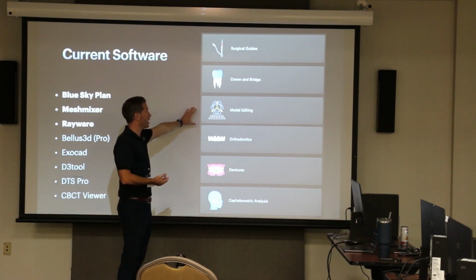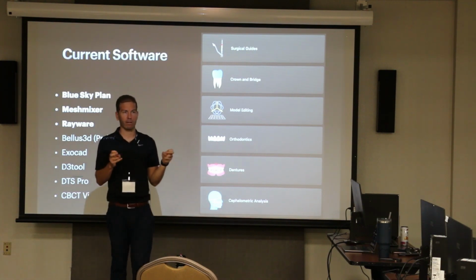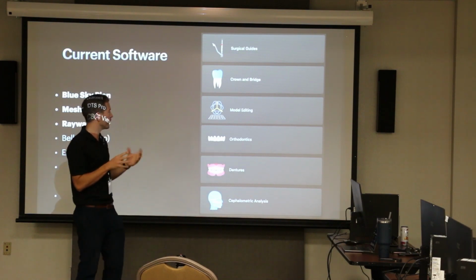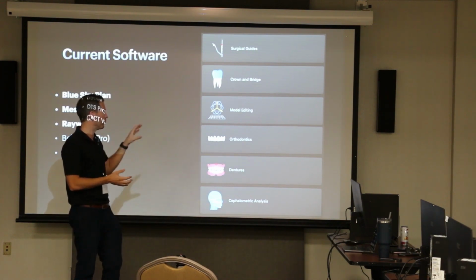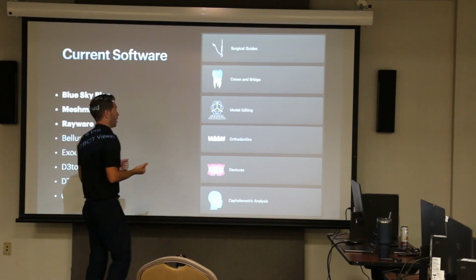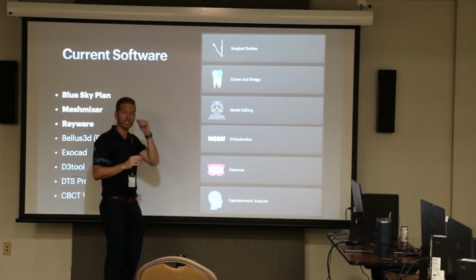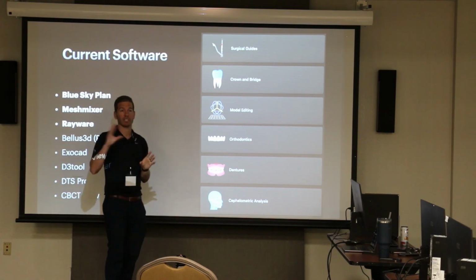And then our model editing is just how you remove a tooth off of a model. How do you digitally extract? It's how you can edit the model itself within Blue Sky Plan without having to leave Blue Sky Plan. And I would say that this module is great for simple, basic editing functions, and it works really well, so you don't have to leave the software.